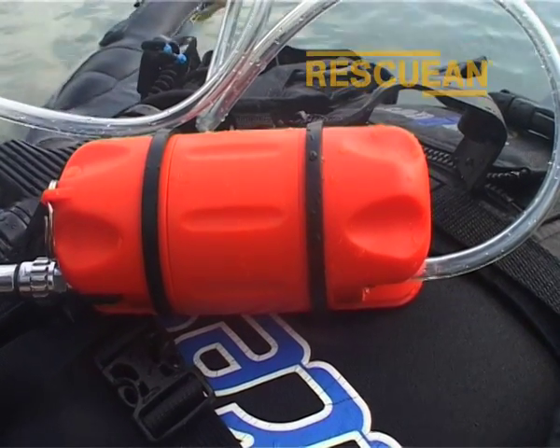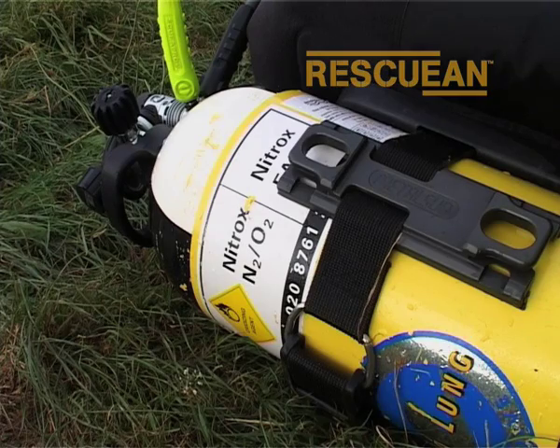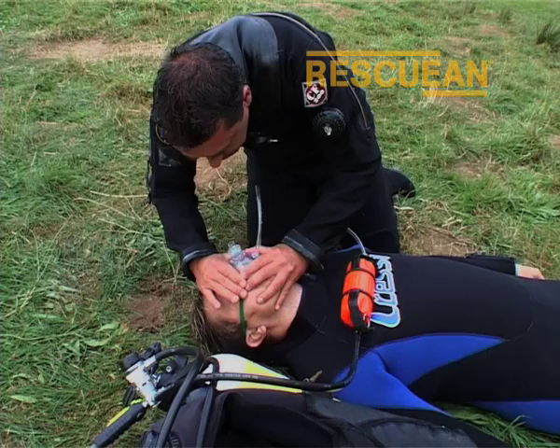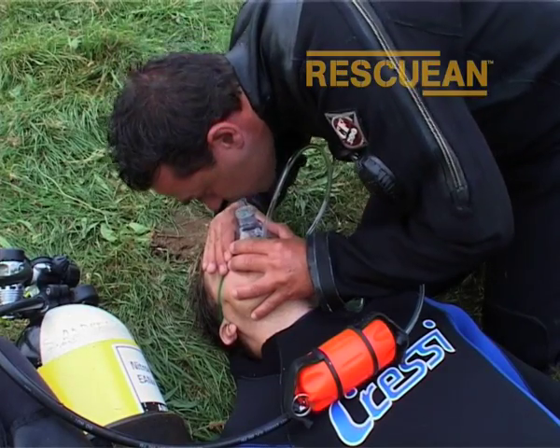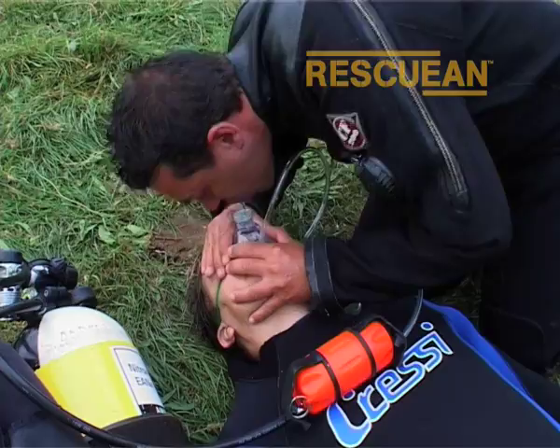The Rescue EAN pod allows a diver's nitrox to be given to both a responsive and a non-responsive patient in a constant, controlled flow of either 15 or 25 litres per minute. The concentration of constant flowing O2 from the readily available nitrox cylinder, combined with mouth-to-mask rescue breaths, is of more benefit to the patient than rescue breaths alone.